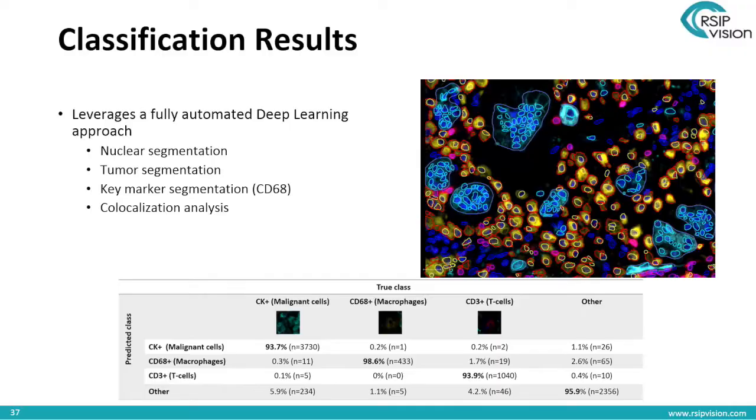This is an example of classification results. So in this case, we had 3 cell types and other, 4 cell types. So other can contain a whole grab bag of different cell types. This is before the finer grain classification of this data set. And again, it wasn't all that big a data set, but many cells. So there are, I think, about 40 slides. Each slide contained many images. So hundreds of thousands of cells in this data set.